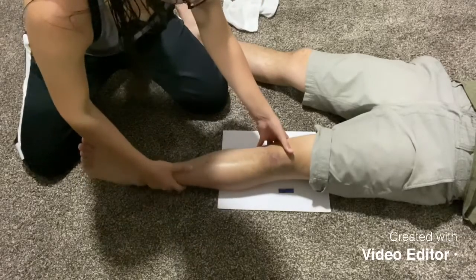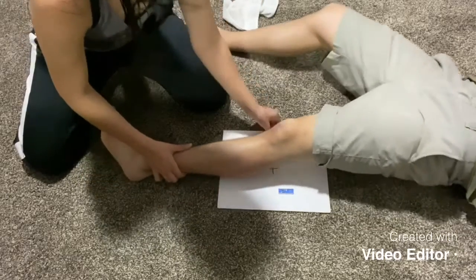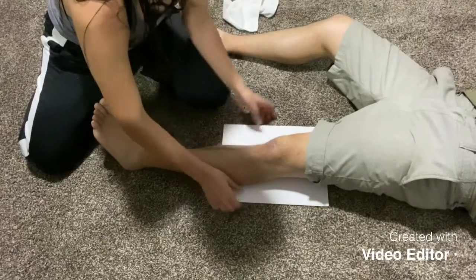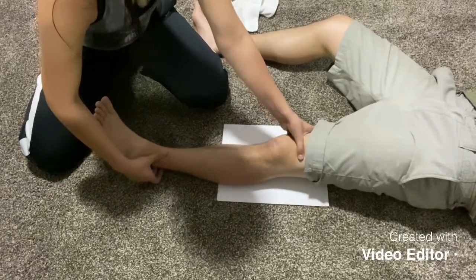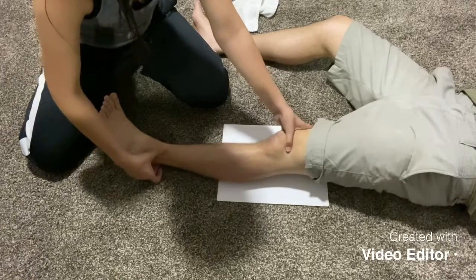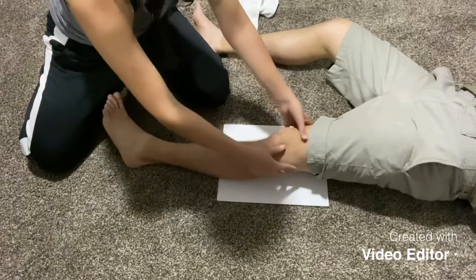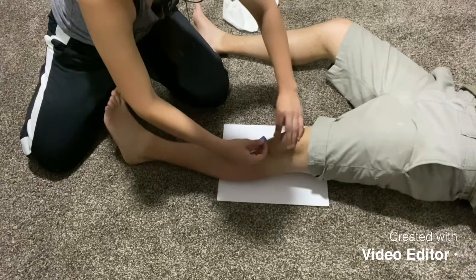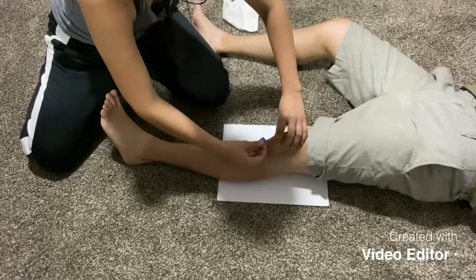For this exam, we're going to again be centering 1/2 inch below the apex of the patella. However, we're going to rotate the entire leg 45 degrees inward, about right there. Centering 1/2 inch below the apex of the patella. Your scar makes it hard to feel.